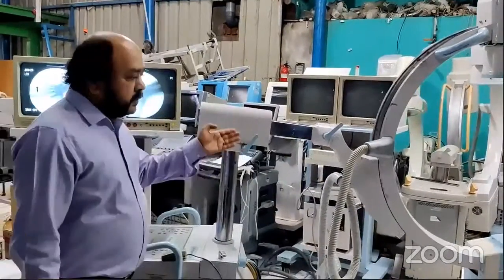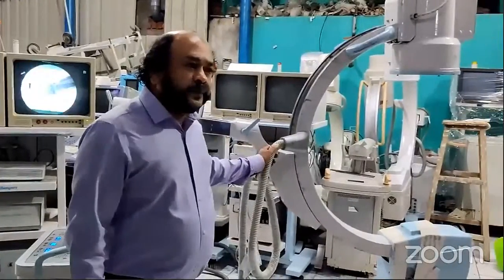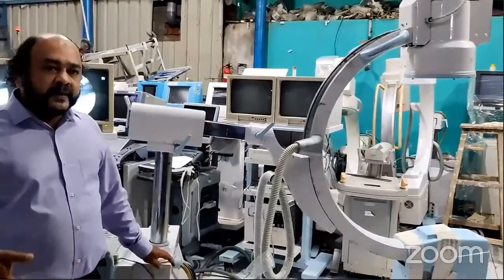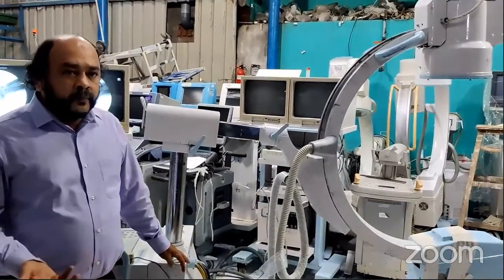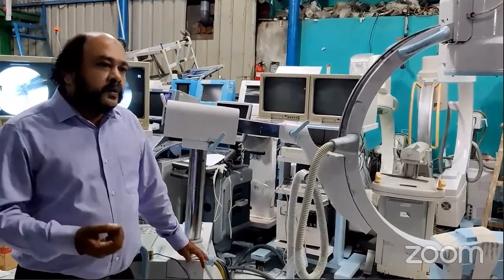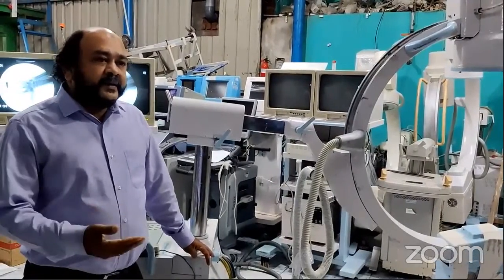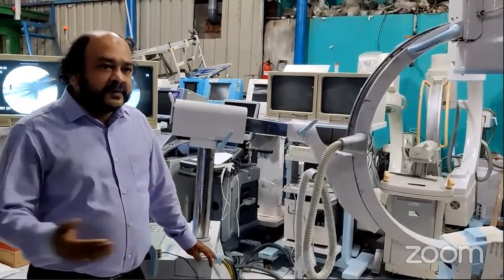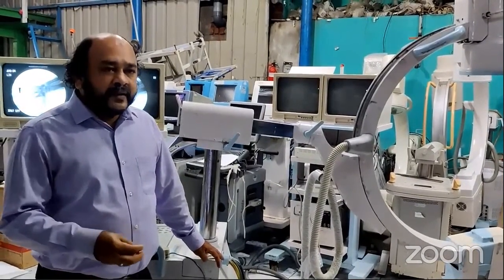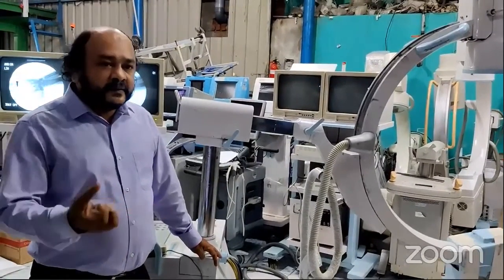They started with ortho. Suppose you want to do any bone cases in the theater, you want to implant anything, keep some screws, or put a plate and all that. After fixing that during surgery, after fixing this type of ortho implants, they want to confirm with the X-ray whether it is fitted properly or not.